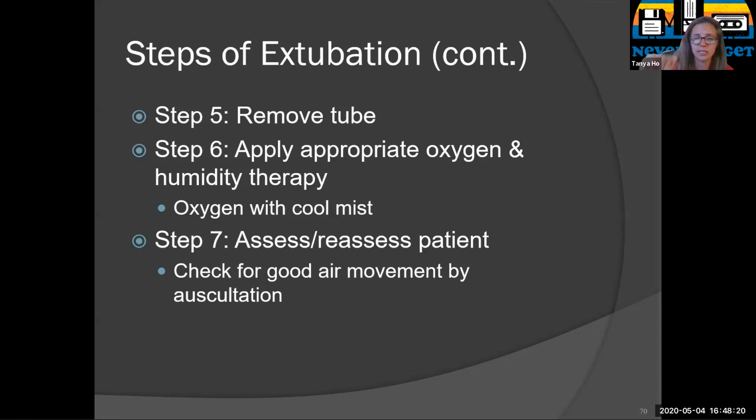You're going to have them sit up and cough, and then you're just going to basically listen over the lungs and the airway. You always listen over the airway, okay? Always. Okay, and so there you go.